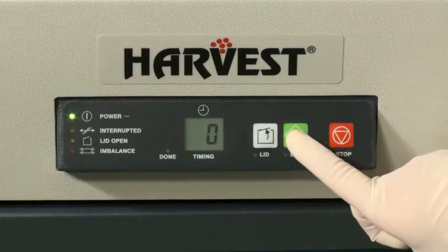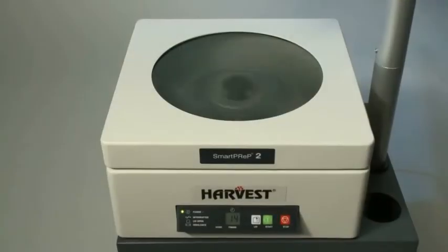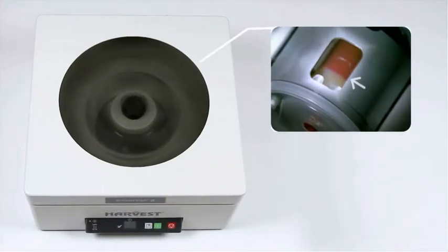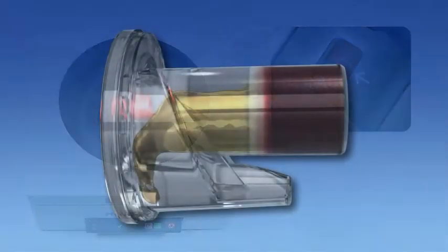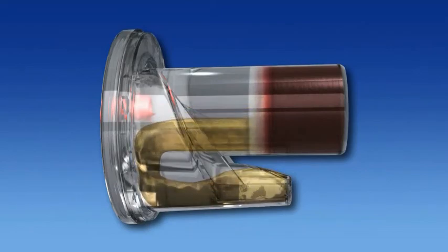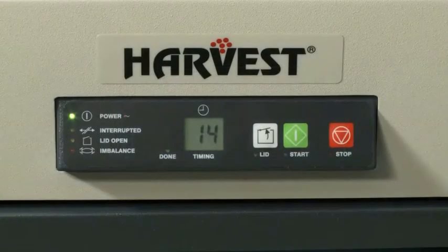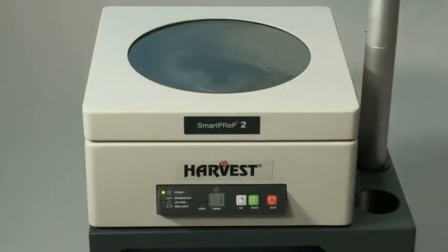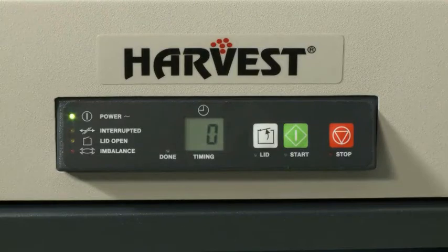Press the green start button located on the front panel of the SmartPrep 2 system. The SmartPrep 2 uses an automated dual spin and decanting process coupled with a self-calibrating floating shelf technology to automatically optimize platelet recovery. The display on the front of the SmartPrep 2 system shows the remaining processing time in minutes. The entire process is automatic and completed in approximately 14 minutes. An audible alarm will sound once the cycle has been completed, indicating that it is now safe to open the lid and remove the process disposable.